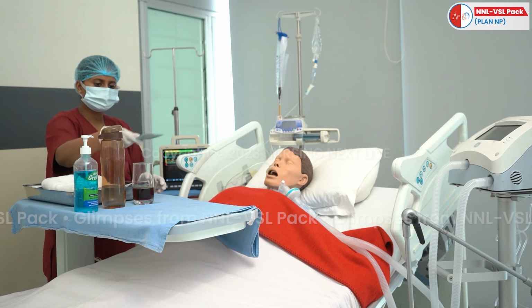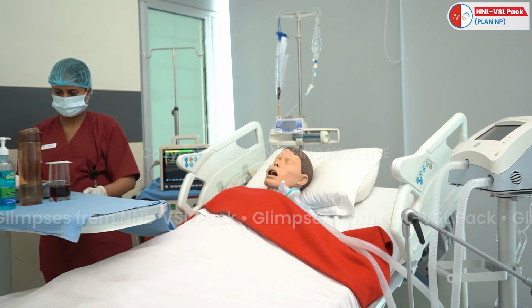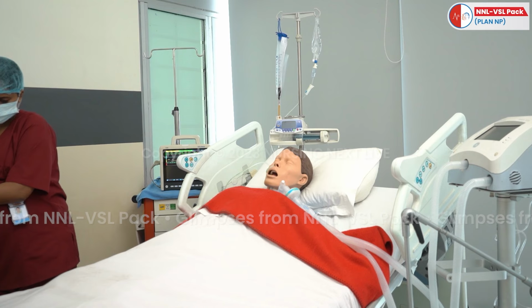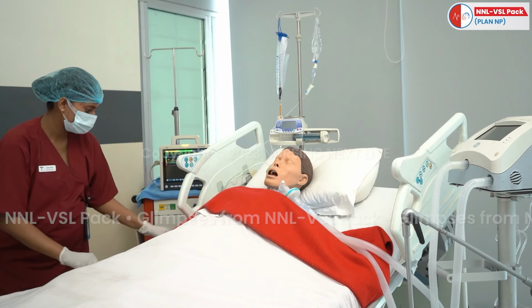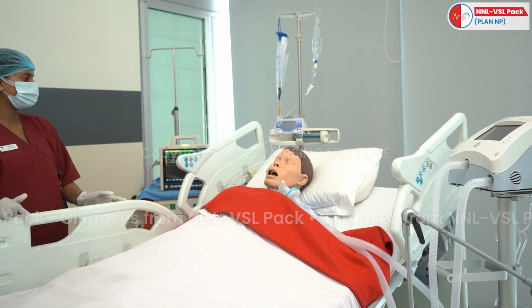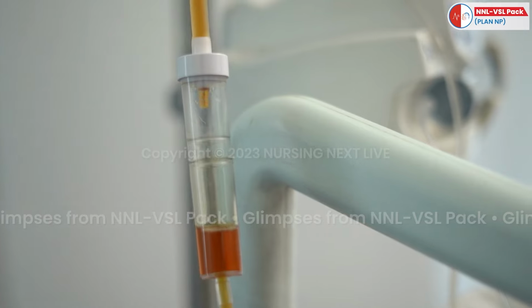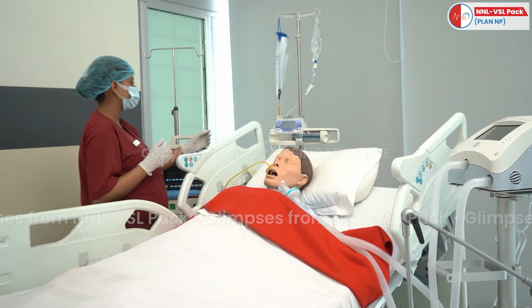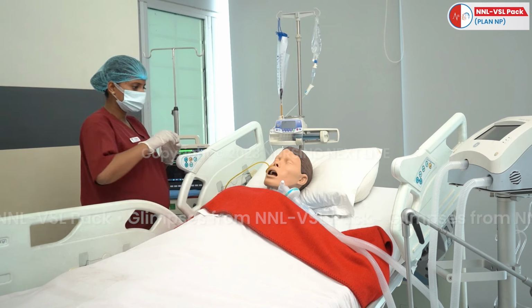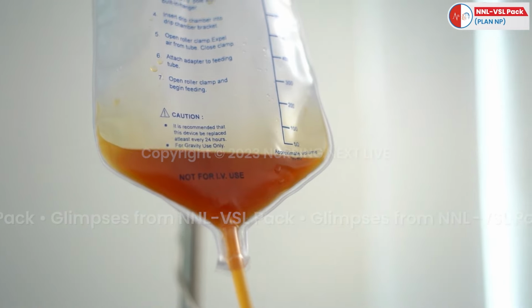After that, you need to come almost 5 minutes prior to the feed finishing. In between, keep observing your patient and the gravity bag. Leave almost 5 ml of the feed in the bag for post-flush.